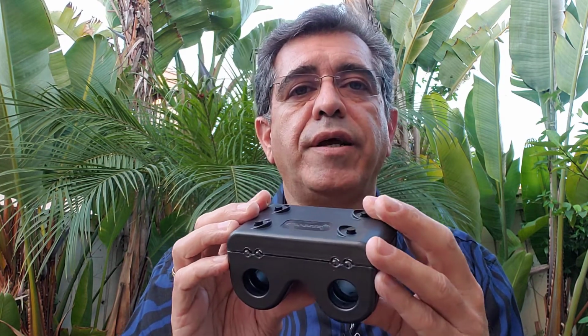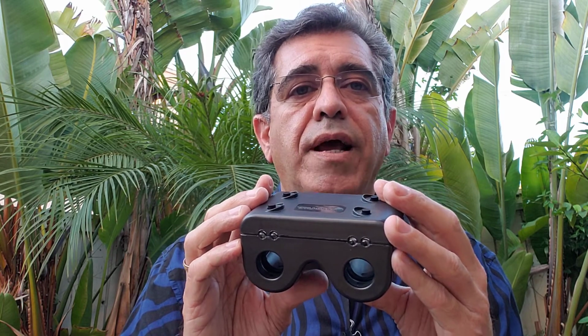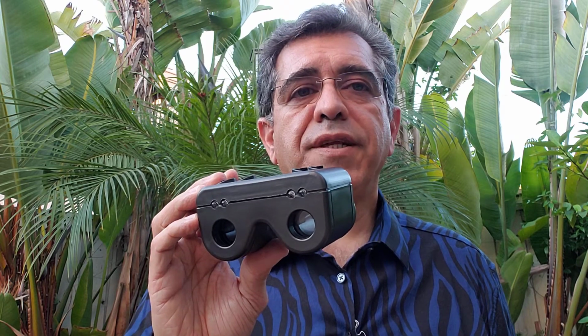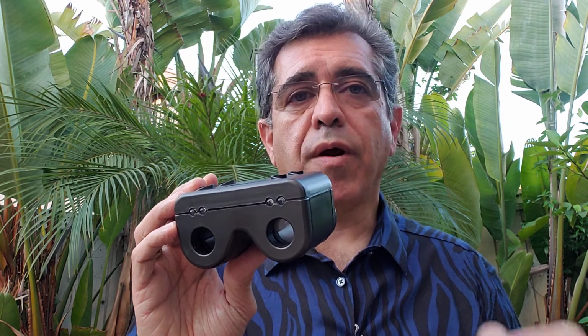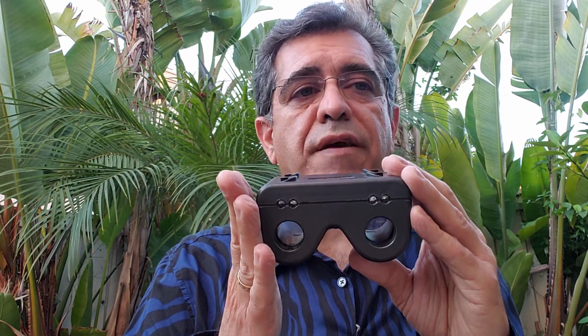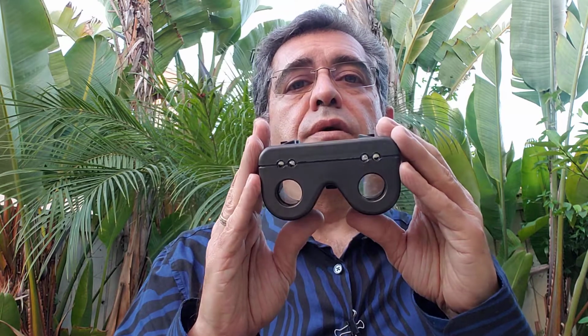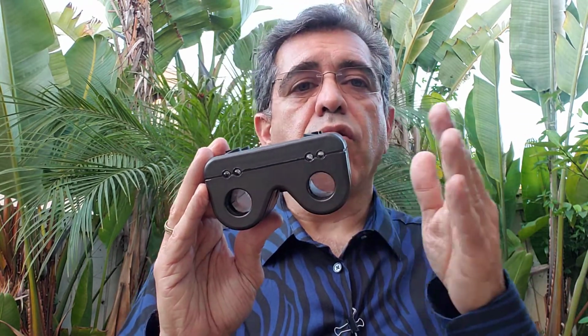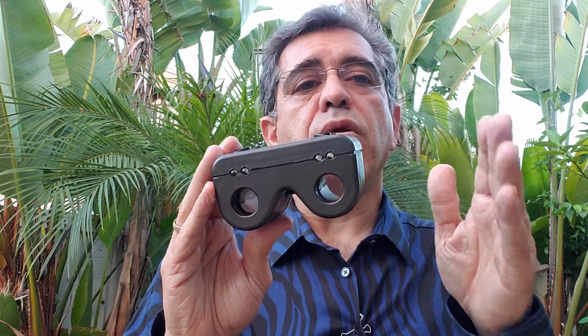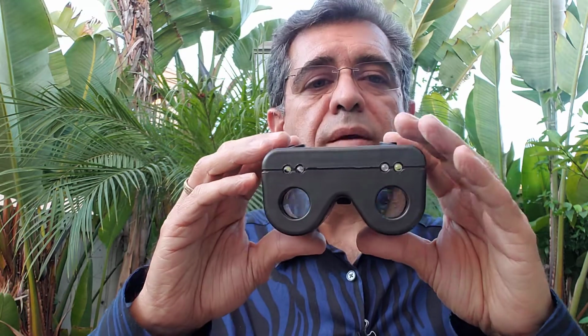The LED lights can be dimmed in steps. The levels are calibrated to the same level as standard neutral density filters. So if you detect the positive APD for the right eye, then you would start dimming the light corresponding to the patient's left eye. You would keep going until you reverse the APD. Then you go back one step at a time to find the best level where there is no APD. I will demonstrate that here.